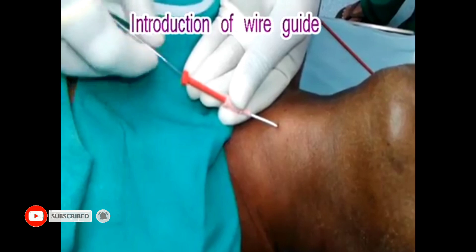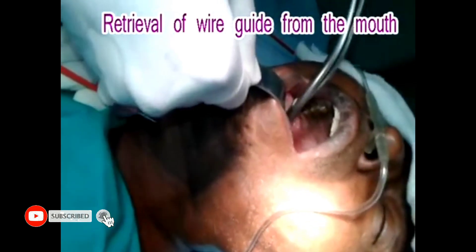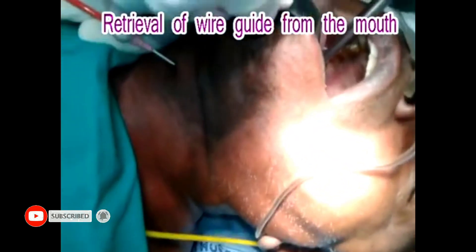Now, the J-tip guide wire is passed through the lower end of the catheter until the retrograde guide wire protrudes from the mouth, and the lower end of it must be secured by a pair of forceps.